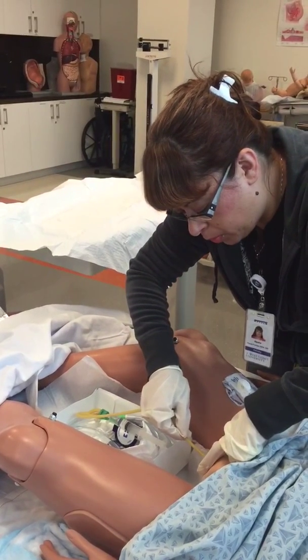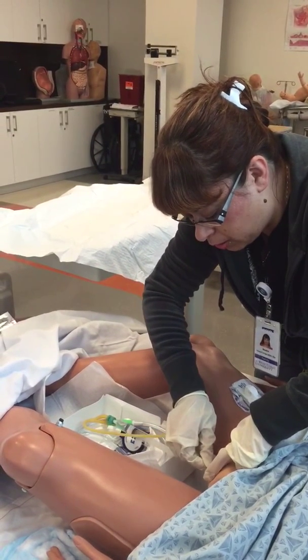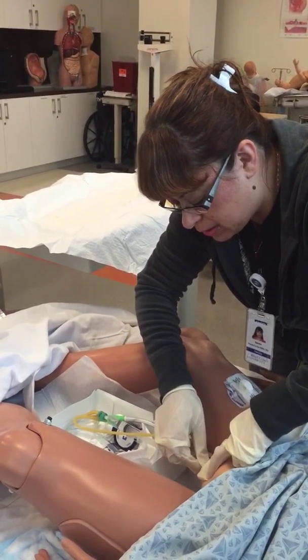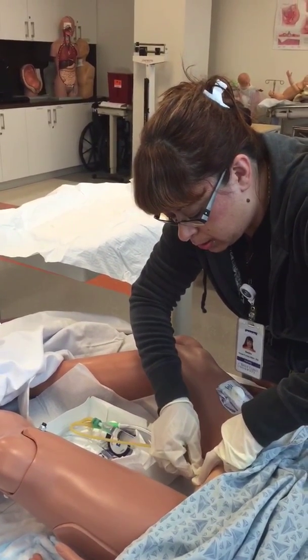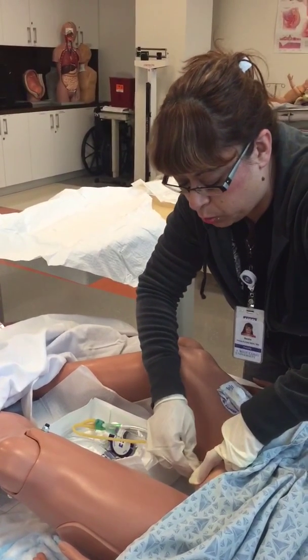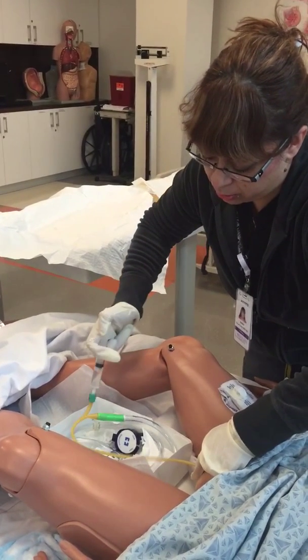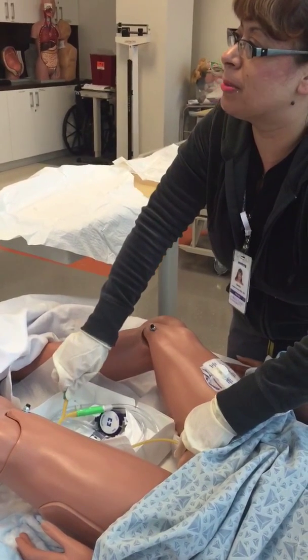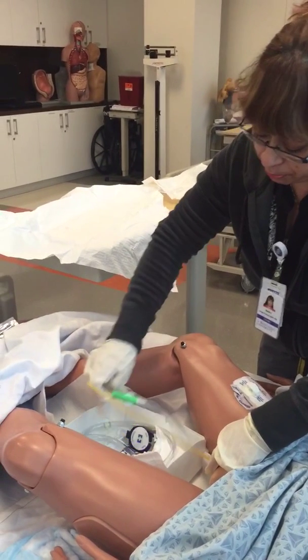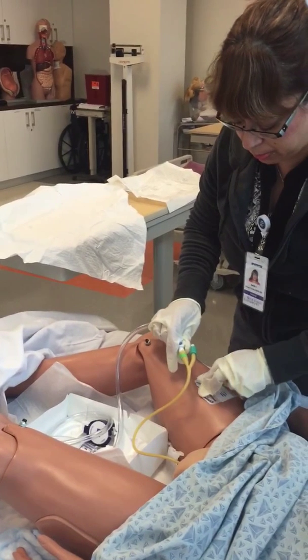You're going to feel a little bit of pressure. Okay, go ahead. With these mannequins, unless they're lubed, it's kind of hard to get it in. But you get it in, and you try not to have the labia close on you. So let's say we got in, you get a flash of urine, you push another 1 to 2 inches. We hold here and inflate the balloon. I'm not going to do this to this mannequin because it's not all the way in because she's not lubed. But let's say it's already in. I'm going to let go now because I already did my balloon.